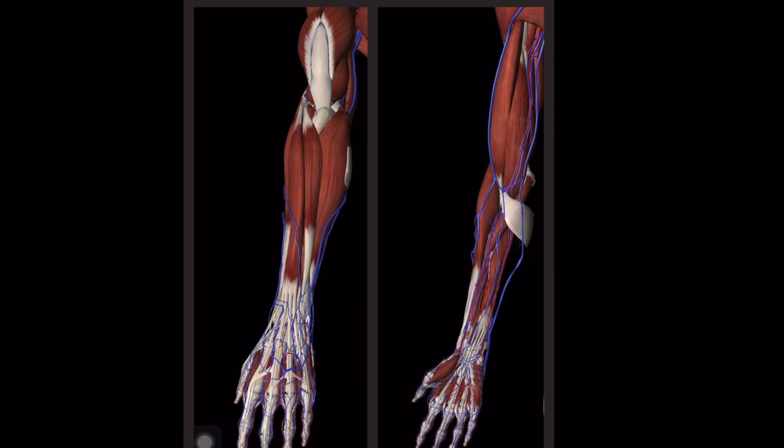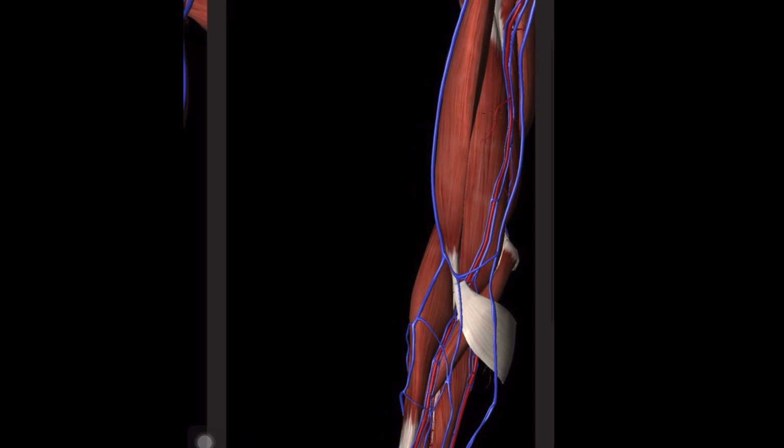For USG guided IV cannulation, we have to put our probe on the medial aspect of the arm. Here you have to locate the brachial artery. Around the brachial artery you can see the brachial vein or the basilic vein. Then you have to continue to follow the brachial artery till the cubital fossa, and at the level of the cubital fossa you can see the brachial vein, medial cubital vein and basilic vein, and you can choose one of them for the IV cannulation.